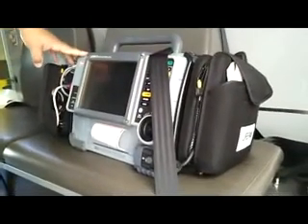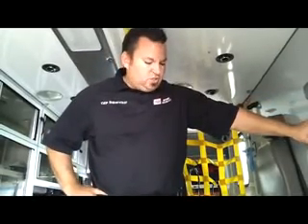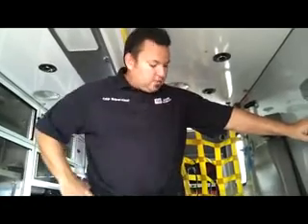It's got an automatic blood pressure cuff. We can do end-tidal CO2 monitoring. So that's big here, like from the channel. If somebody's been down the channel all day and we suspect maybe CO poisoning, we can hook them up to all that and make sure that they're oxygenating okay.